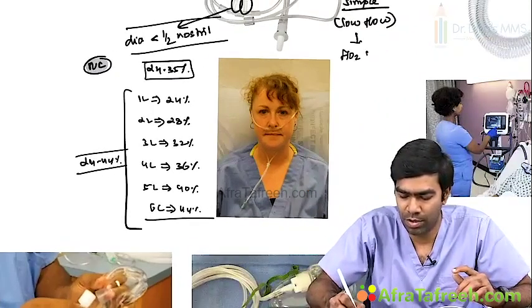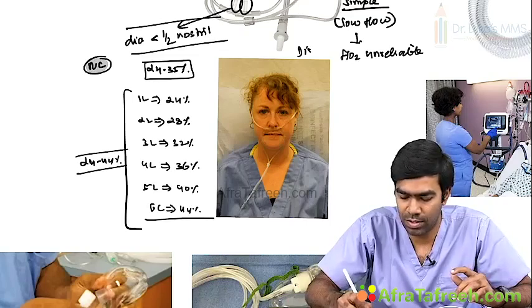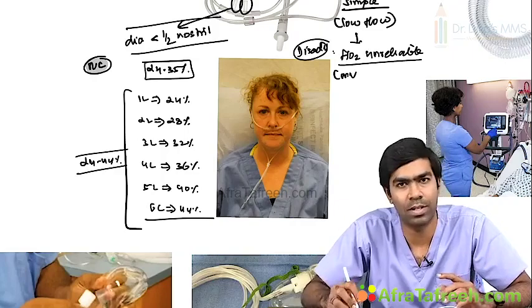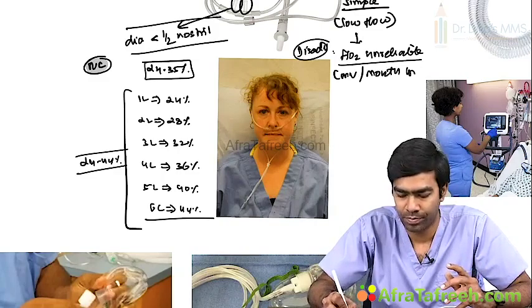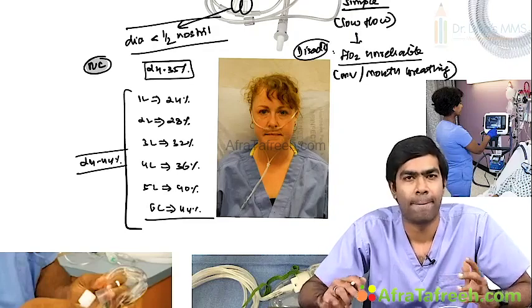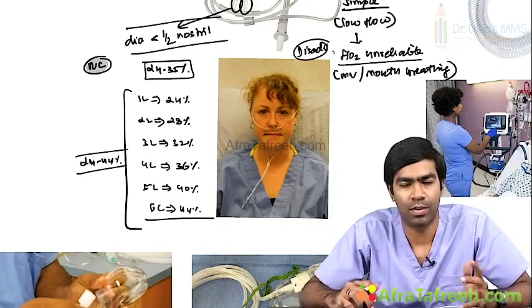It's very, very important. FiO2 is unreliable, and it's a very important disadvantage of this device. Because it's a low flow device, the FiO2 will be unreliable. The FiO2 will depend on the minute ventilation of the patient, which in turn depends on the tidal volume and the respiratory rate, and it also depends on the extent of mouth breathing by the patient.